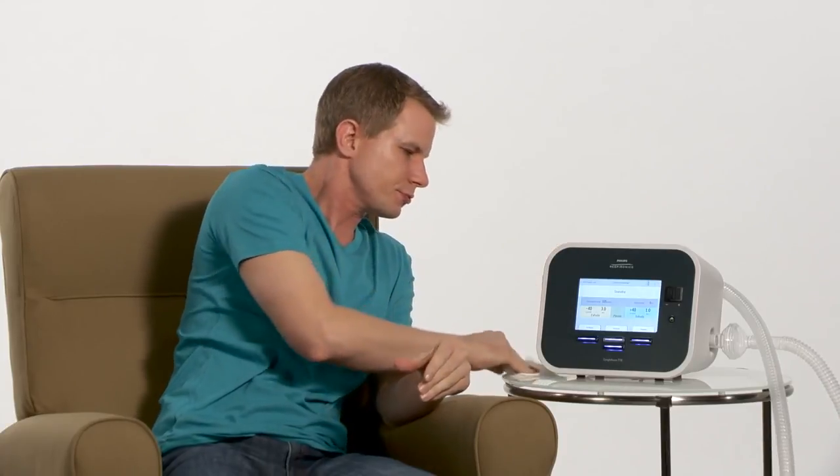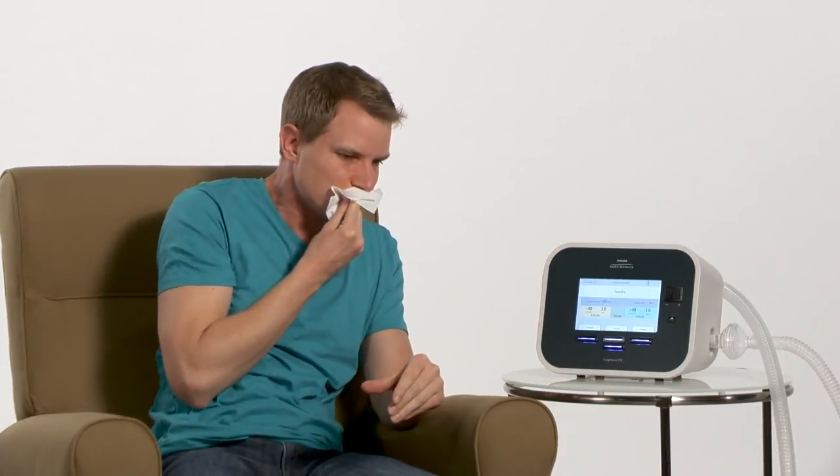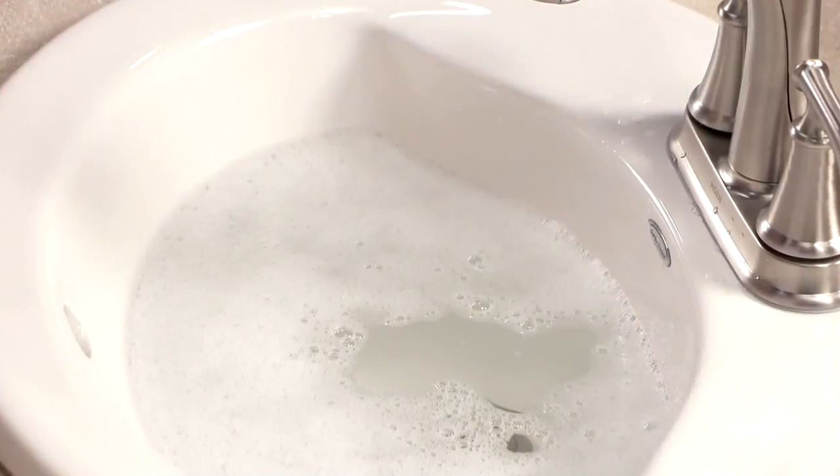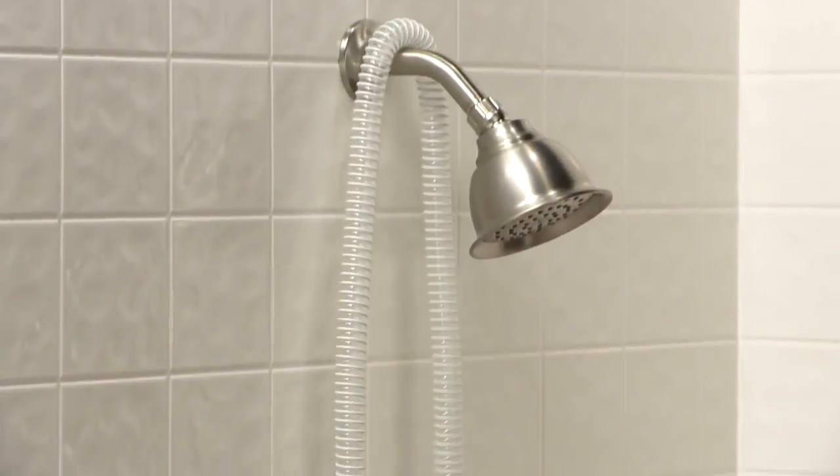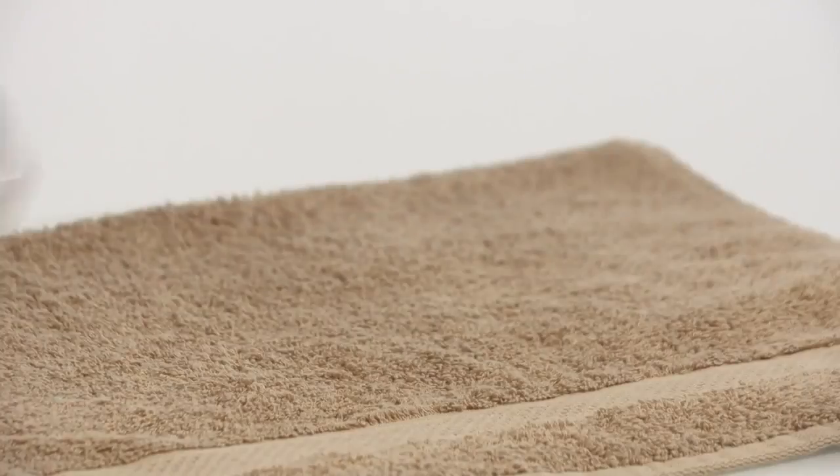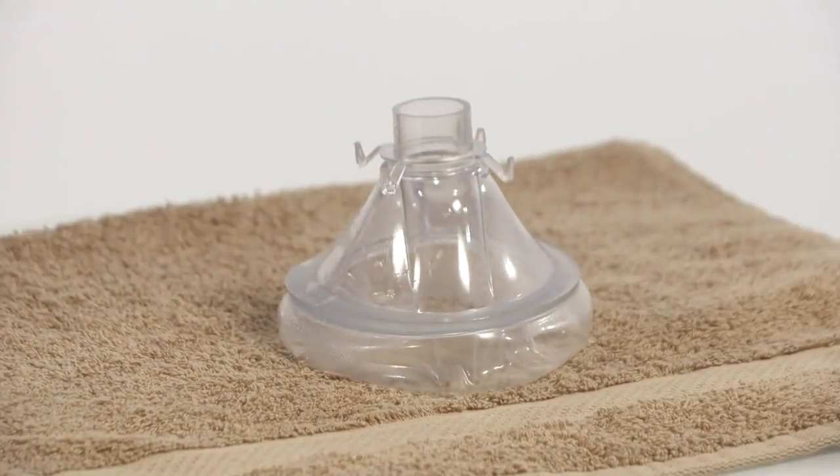After the treatment, clear any secretions from his mouth, tubing and patient interface. It is important to wash the breathing circuit and patient interface with mild liquid detergent and water. The parts must dry completely before next use.